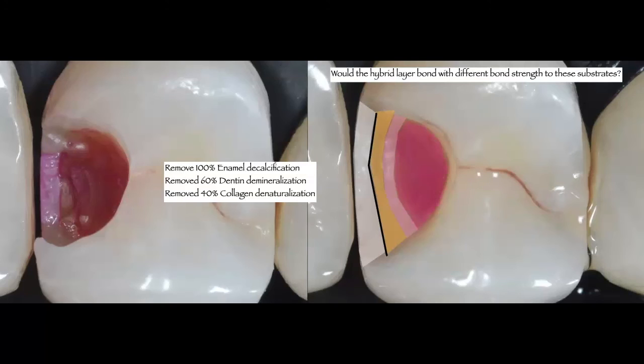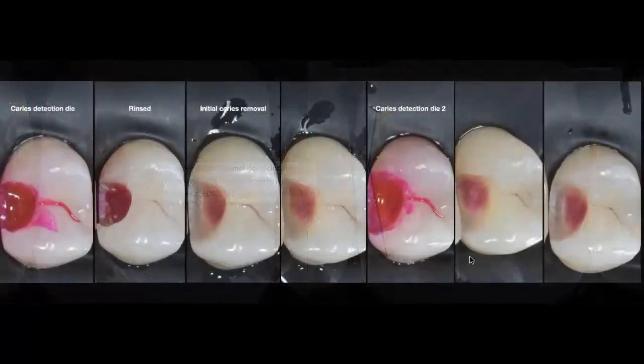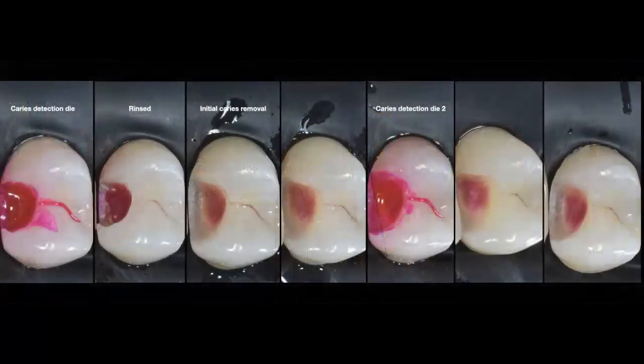This is a younger patient. He's in his early 30s, with a large pulp chamber, and again, I don't want to get closer because I know that I'm at least right now 4 to 5 millimeters in depth. I'm very close to that 3 millimeter mark from the neighboring tooth. I want to be careful in that area so that I don't expose anything and keep this tooth vital, which is always going to be my goal.